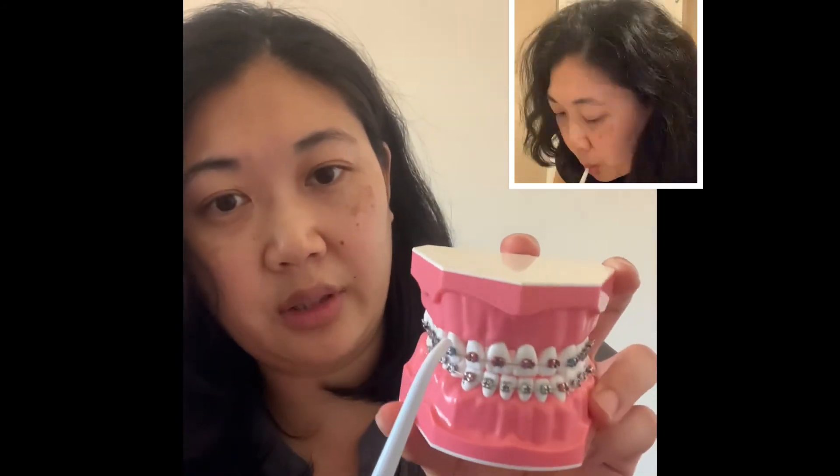This tool right here is amazing. It has a 360-degree handle so you don't have to twist your hand — you just twist this here and it can go all around your mouth. All you do is open this up, fill it up with water, and you're ready to go. Get this in your mouth, close down on it, and spray in between and around the gums.